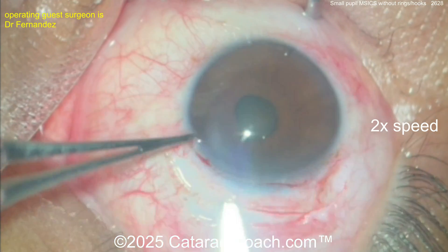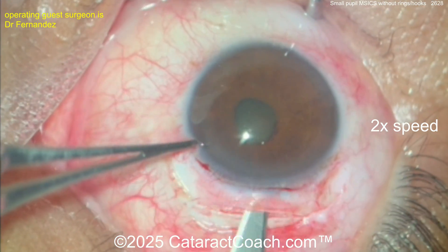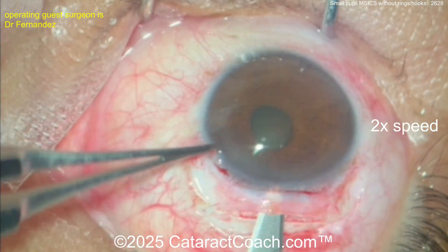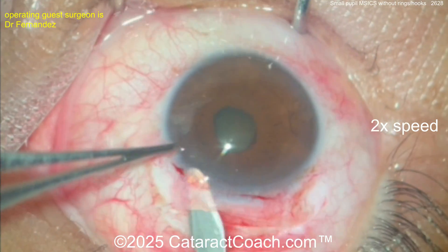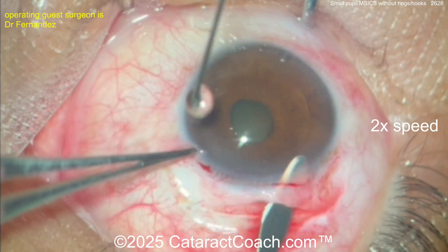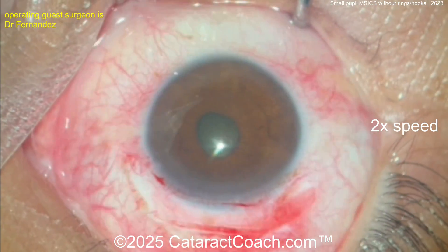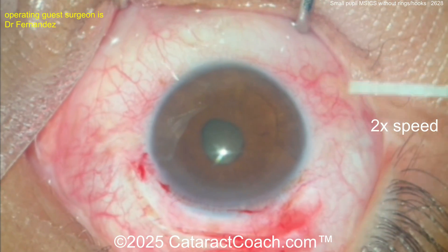Once you achieve that half scleral depth groove, get the crescent blade and nicely dissect a tunnel. Remember this is going to be a little bit trapezoidal in nature so the inside opening in the eye can be a little larger than the outside opening. Look at the tunnel length — at least a couple millimeters before you even enter the AC. At this point the AC is not entered.